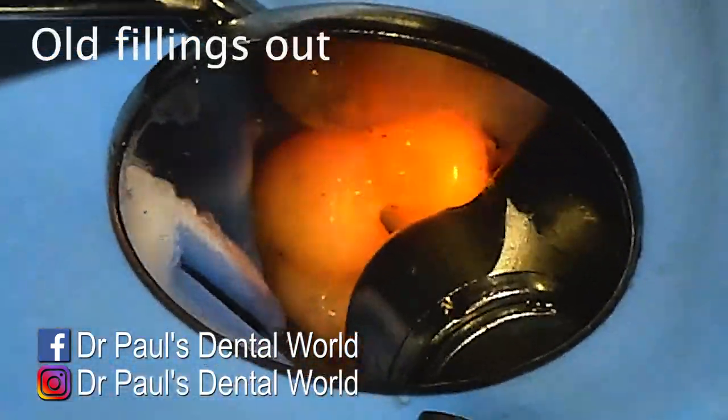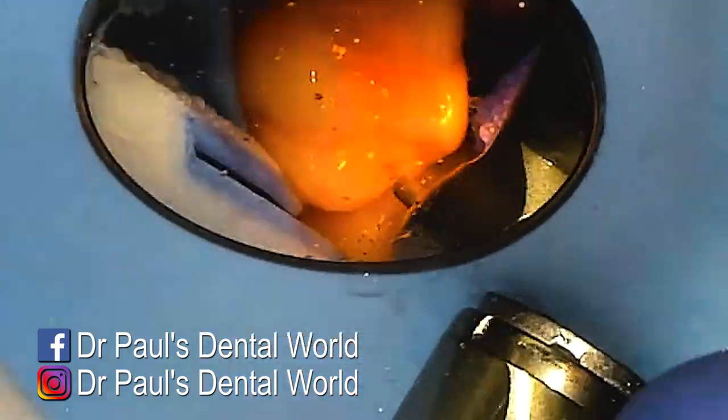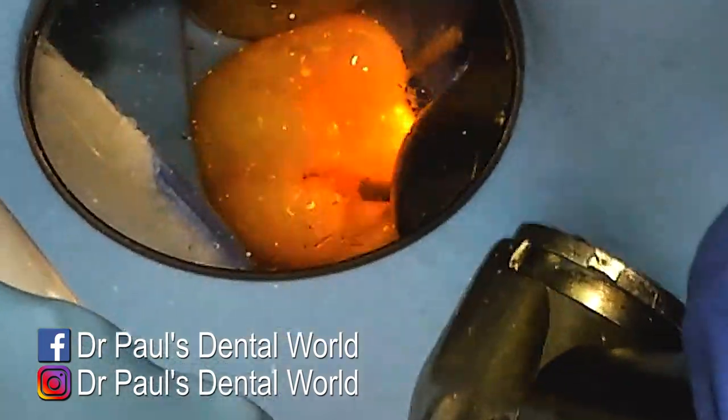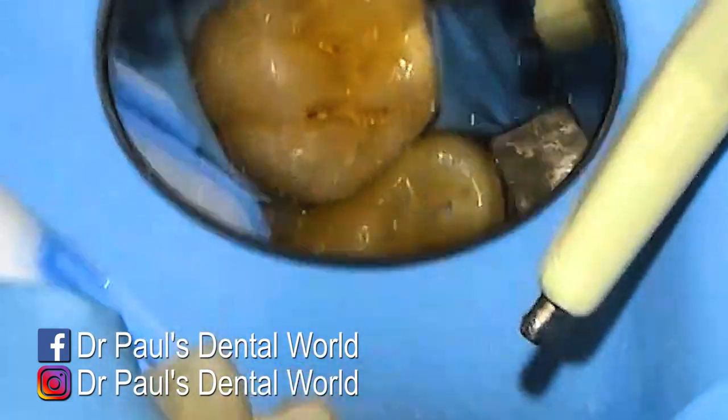We start off by removing the existing fillings and I do this with a high-speed round diamond burr. I don't want to remove much more than the filling itself, just enough so I can assess what's happening underneath. When we look at that, you can see there's a little bit of decay on the front filling and a bit on the back as well.